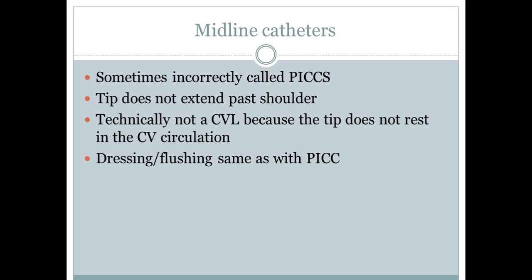But again, your dressing changes, your flushing, that is going to be the same as with central lines or your PICCs.